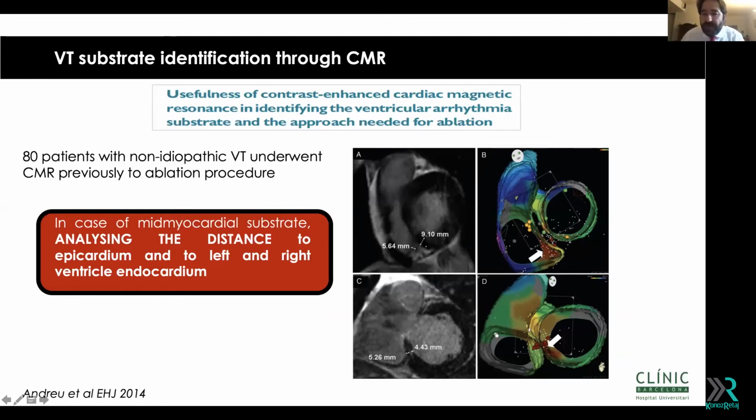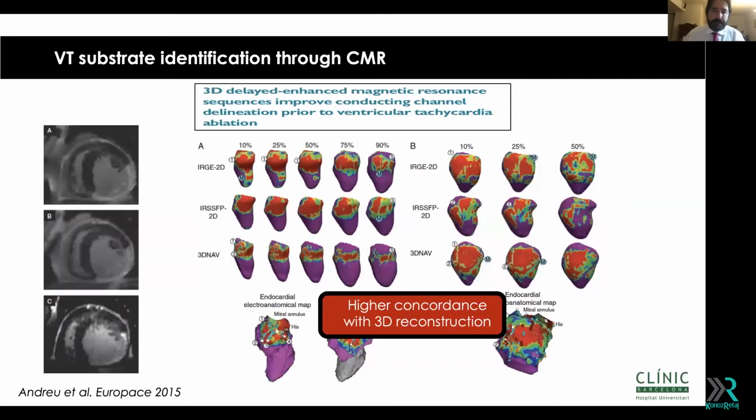So there are a lot of things that you can do even nowadays with MRI and a new software that can make your life easier in terms of VT ablation. If you have the ability to do a 3D MRI, it's even better.